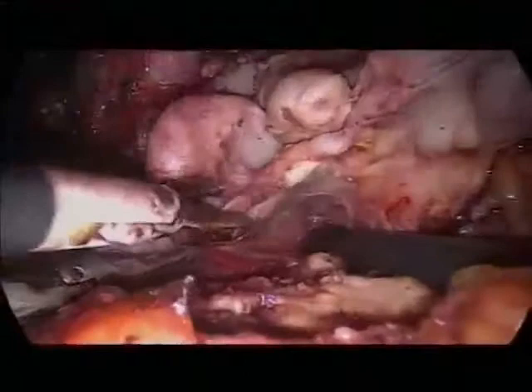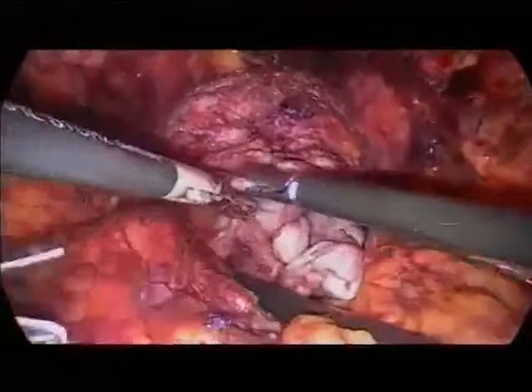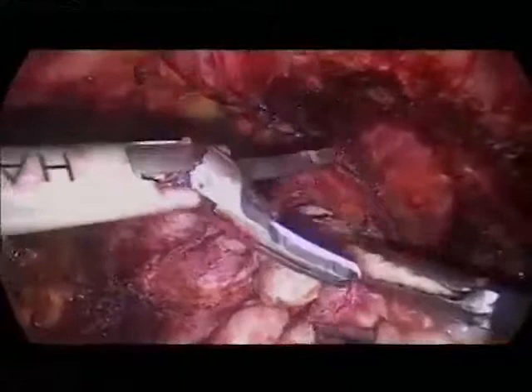When we do nerve sparing, as I would like to show you now, we stop now using the ultrasound because I don't want to have any thermal energy when we come close to the nerves. But I think on top of the prostate, what we did here at the bladder neck, there is no risk of injuring anything with this. So for this reason, we use it, and now we stop.